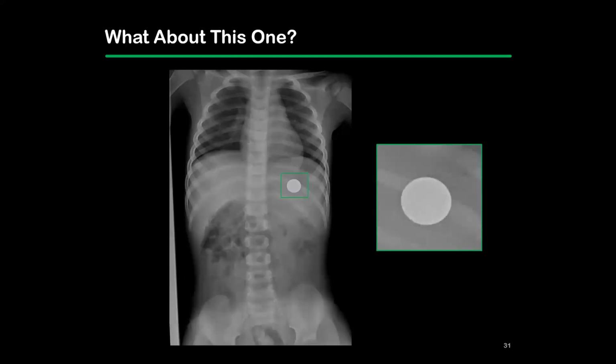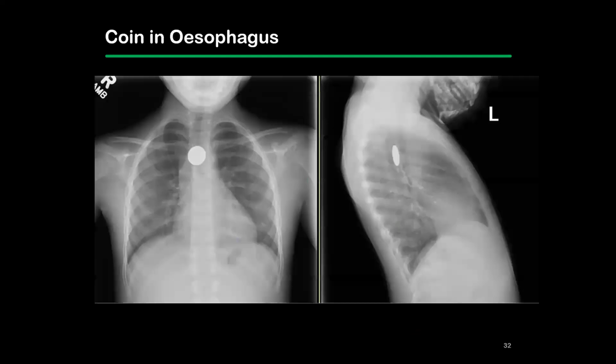This is an ingested foreign body. This may be a little bit hard to see, so I blew it up, but we see it's a uniform circle. So this is what a coin looks like. If it's just a uniform radiodense circle, it's most likely to be a coin, especially if it's flatter on one view. Here's a coin in the esophagus. So again, a very uniform radiodense circle. And then when we do our lateral view, we can see here's the airway and here's the coin that's present.